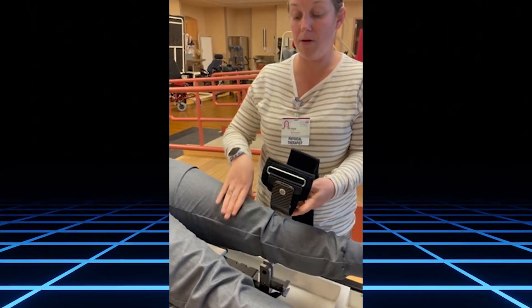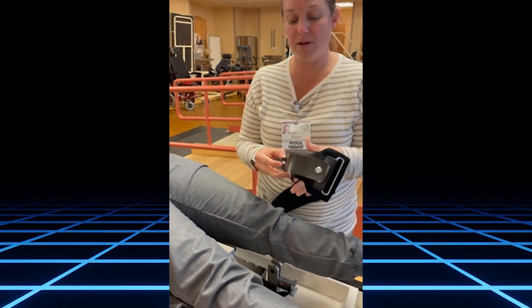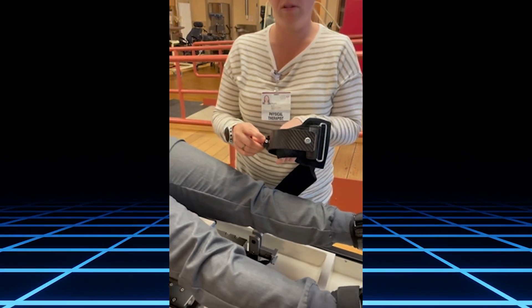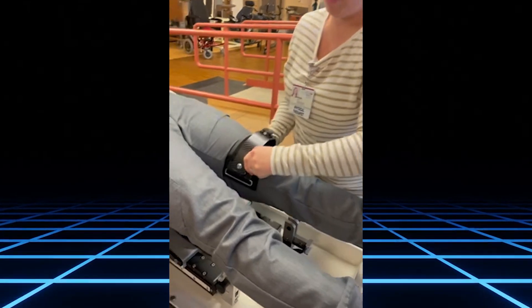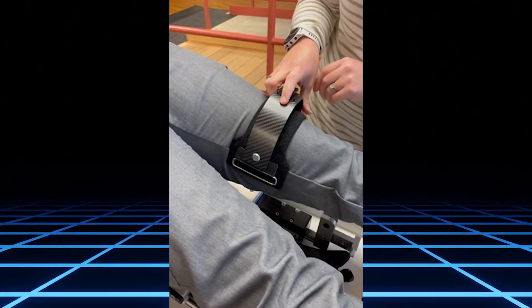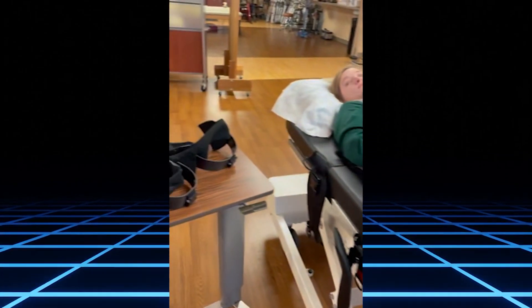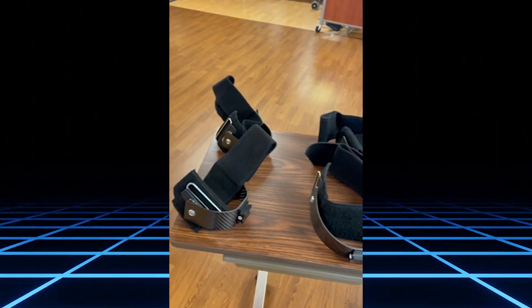Position the cuff about four fingers above the knee. There are different sizes of cuffs depending on the size of your patient's thigh. We are using cuff seven. I can tell this is the correct cuff because it is tight and firm but fits the area appropriately. The cuffs are labeled five to eight, with five being the smallest and eight being the largest.